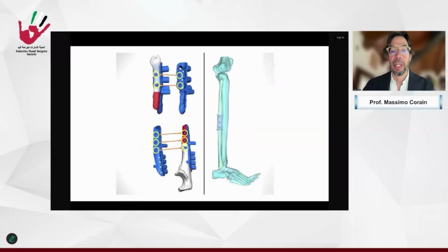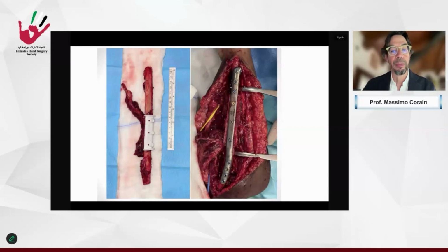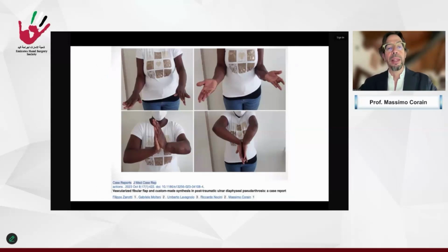This is the template for the fibular graft, and these are intraoperative checks of the plate removal, the cleaning of the soft tissue, the template for the osteotomy, and the final check with the plate and the fibula. And this is the bone healing with a good alignment of the forearm, with a good motion. Obviously, you see the forearm, how small it is, with the scarring of the previous surgery.